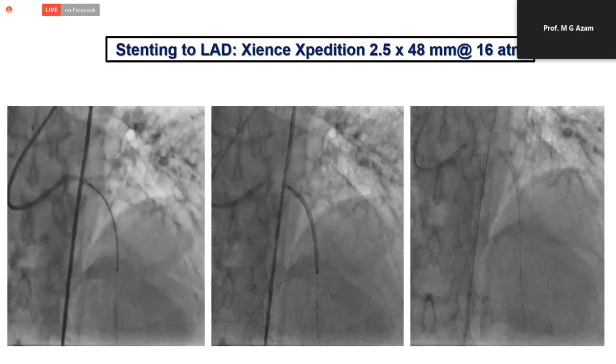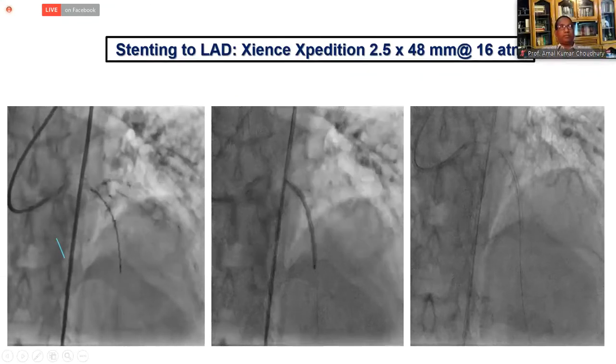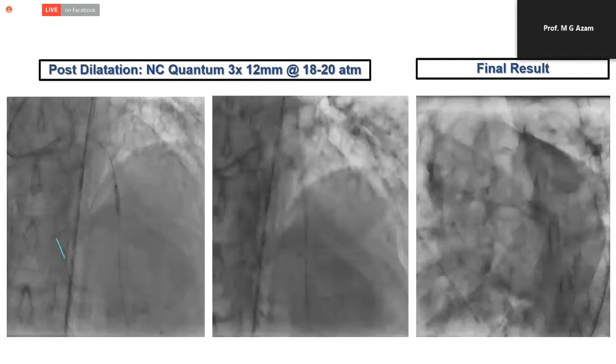That is not moving. Sorry. Okay. So this is the post dilatation. This is the final result.